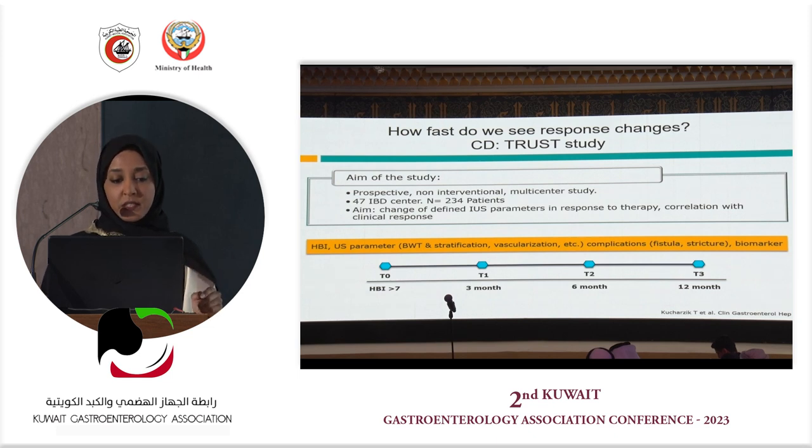According to the TRUST trial that was published in 2017 by the IBUS group, one of the IBUS team members, there is a prospective multicenter trial, including 47 centers, with a cohort of more than 200. The aim is to identify whether intestinal ultrasound will help in knowing if the patient is responding well to the medications or not. They monitored the patient at week zero, 3 months, 6 months, and 12 months.